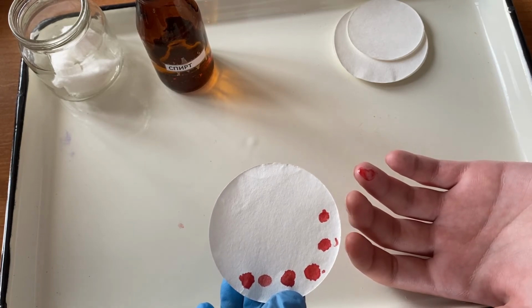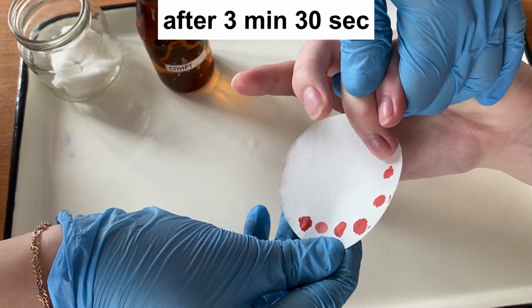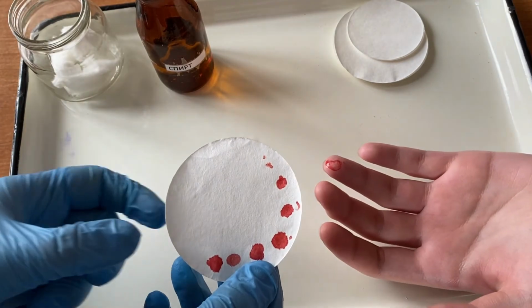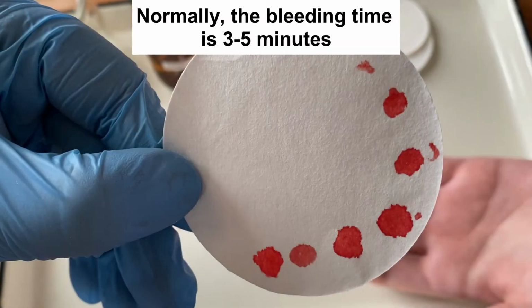As soon as the moment comes when new drops of blood do not form, that is, there is no trace of blood left on the filter paper, turn off the stopwatch and record the total duration of bleeding. Normally the bleeding time, according to Duke, does not exceed 3 to 5 minutes. Its increase is observed with severe thrombocytopenia or severe forms of some thrombocytopathy.